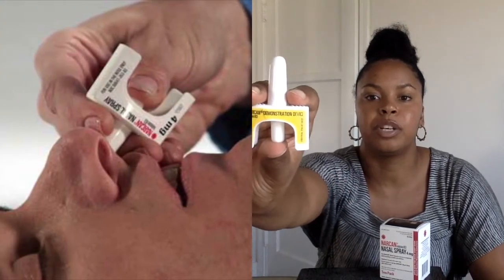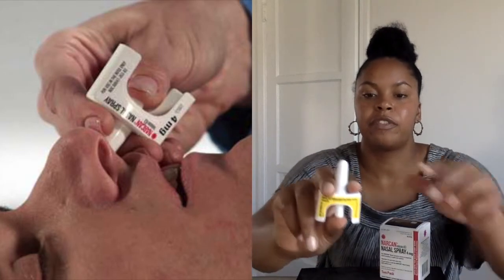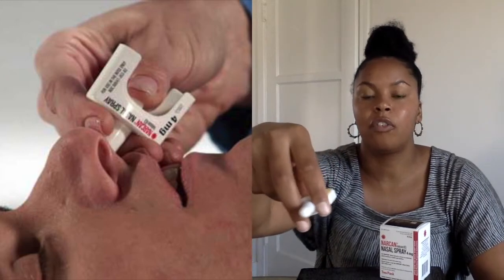Once you come to the conclusion that someone is experiencing an opioid overdose, you're going to want to call 911 right away. You want to make sure emergency personnel are on their way before you start to administer naloxone. Once that's done, lay the person on their back if they are not already. Then grab the first dose of naloxone, insert the nozzle into their nose, and push. When the nozzle is inserted, make sure that your fingers are forming a seal over their nose.